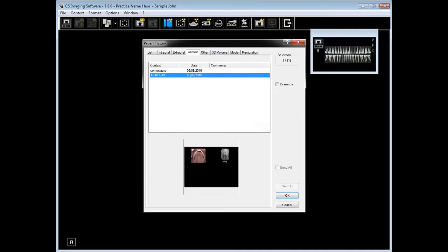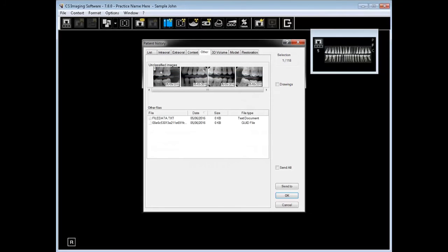If images were saved in a context, they can be retrieved from the patient's history under the context tab. When images are imported, if they're not classified, they get saved under other. These are usually scanned images.